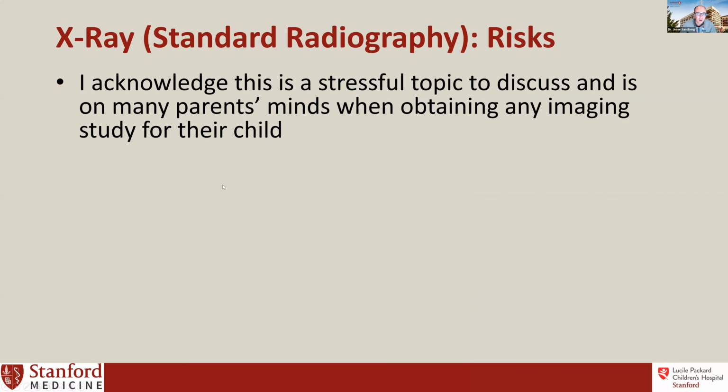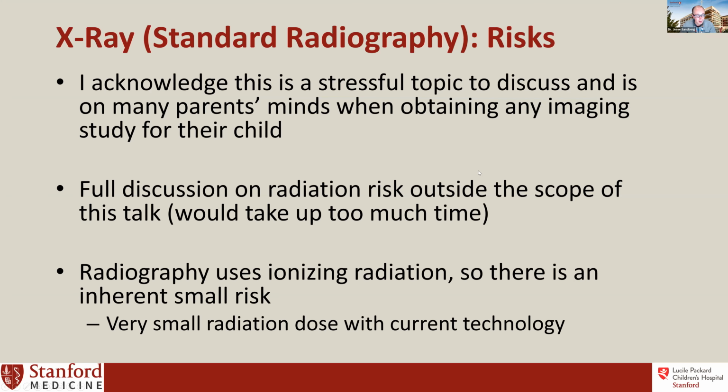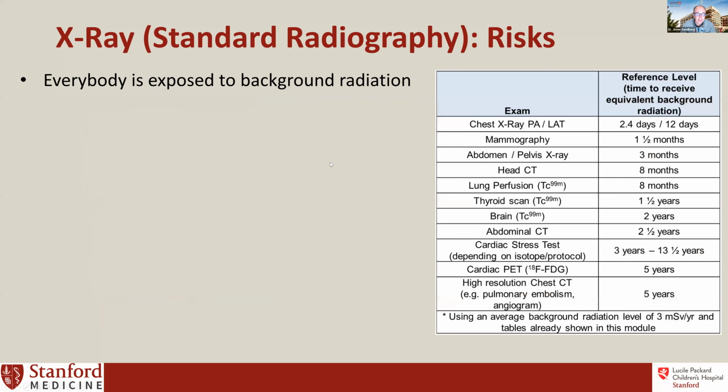All right, so there are some inherent risks, as all of you are aware, in terms of any ionizing radiation. I know this is a stressful topic when obtaining an imaging study for your child. I'll be honest, it's a very long topic, and it's really outside the scope of this talk, but I will discuss it briefly here. So, it does use ionizing radiation. As we know, there's a small inherent risk. It is a very, very small dose with the current technology we have today.